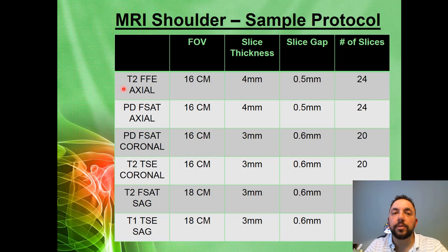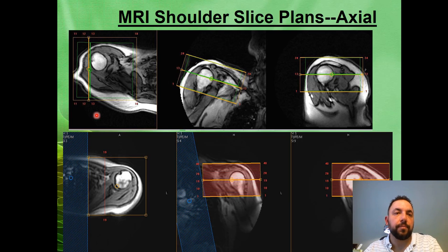A gradient echo is a good starting point. PD FATSAT, excellent proton density imaging in all of MSK applications, as you get a really good look at tissue contrast with fat suppression, as well as good ligament and tendon evaluation.